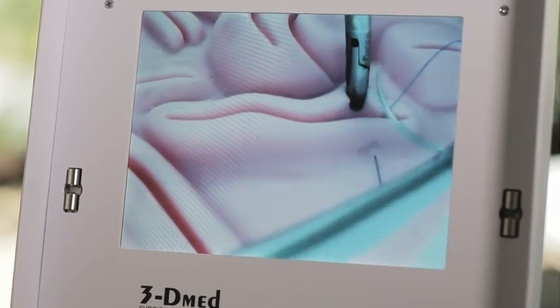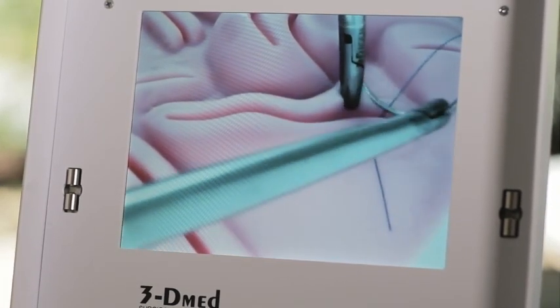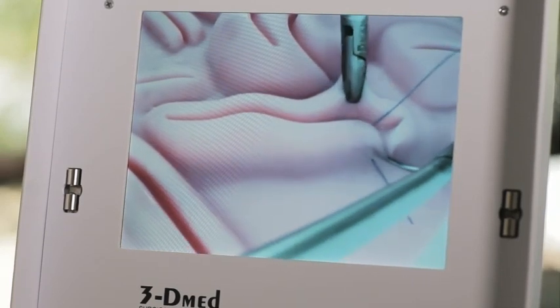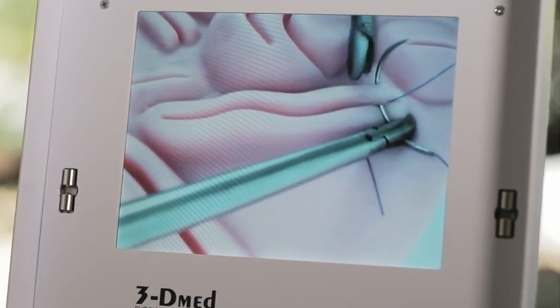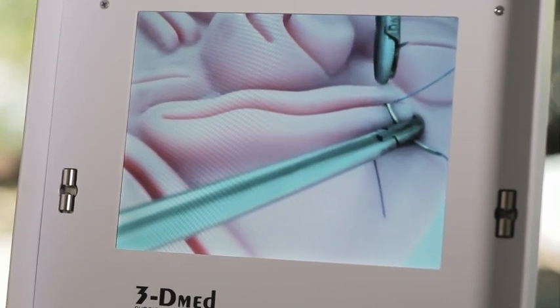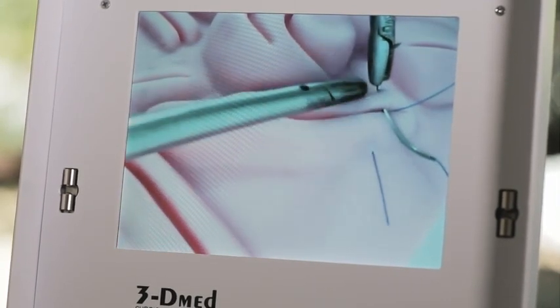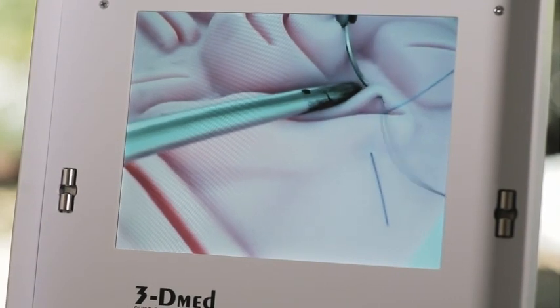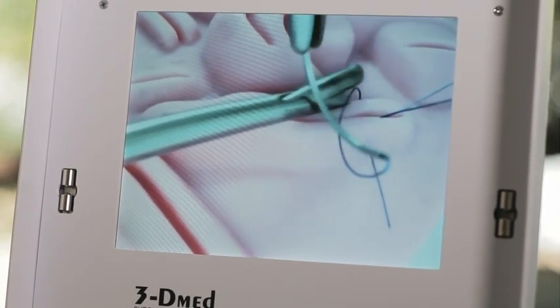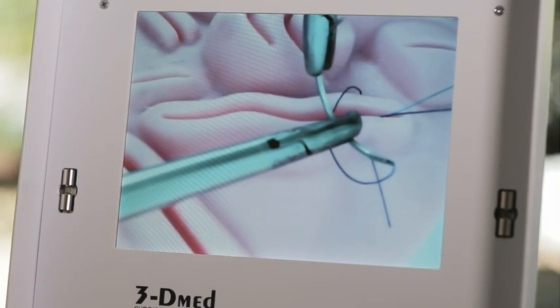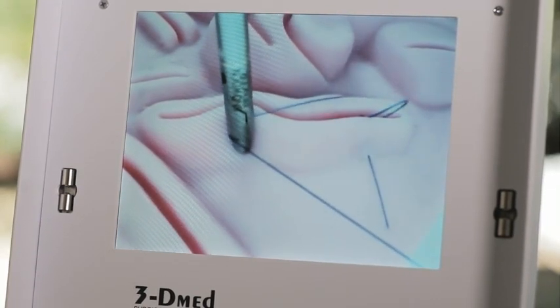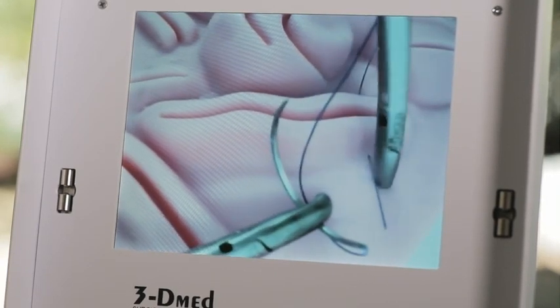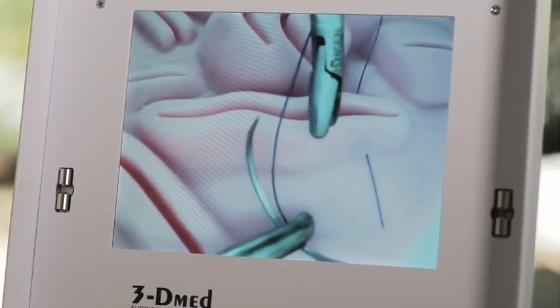I'll lift up the anterior lip of the vagina, touch it, back away and pass the needle through, turning it all the way so I can re-grasp it without changing orientation. I'll pull it through and re-grab with no wasted motion. Note that I left a very short tail about two centimeters.